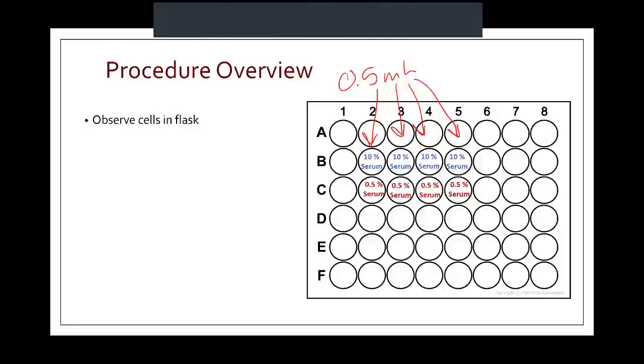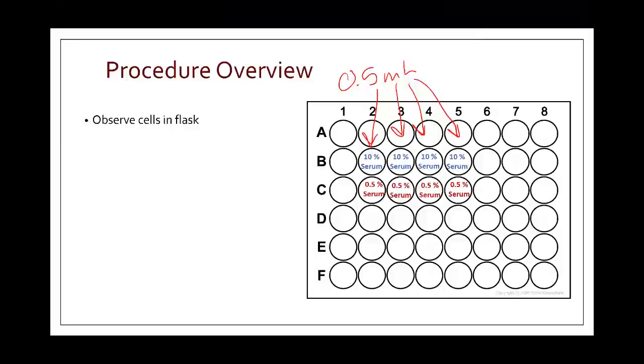Just some tips overall. You're going to observe the cells in your flask before you trypsinize them. Taking a picture in the microscope is going to be needed for your post-lab. Don't forget to do that. Don't forget to save your picture.